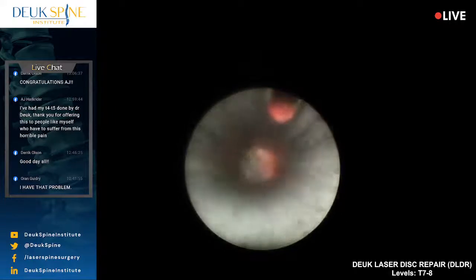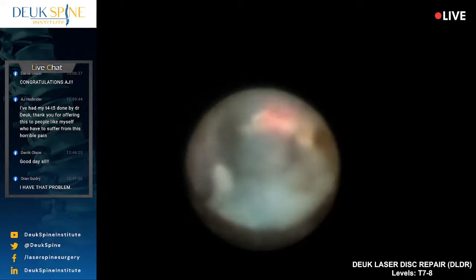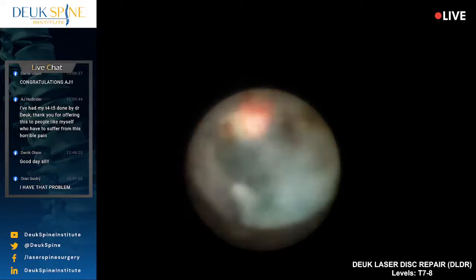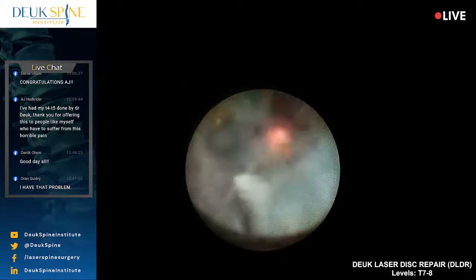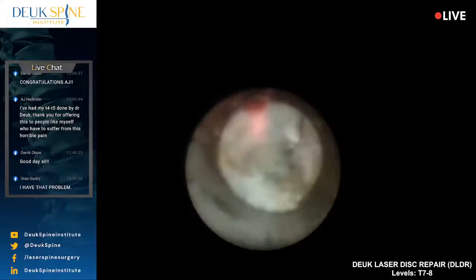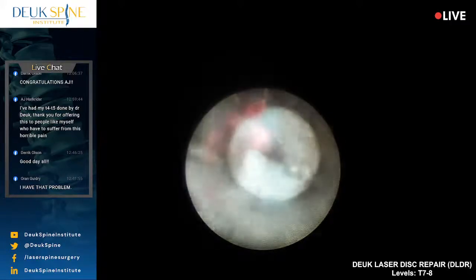So we're just going back and forth, working on this herniated disc. And the blue stuff, by the way, stains degenerated disc material, nucleus, not the annulus, just the nucleus. So Flynn, your job is to remind Luis, okay? About this scope. All right, there's more of the herniation.